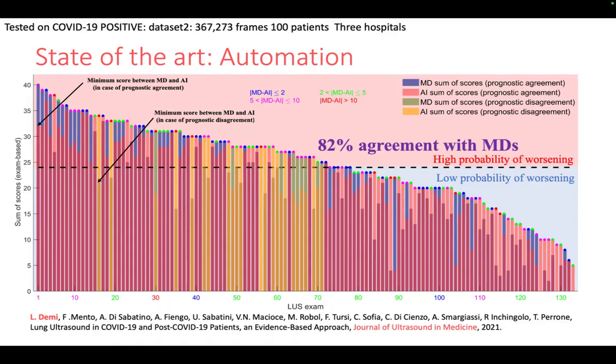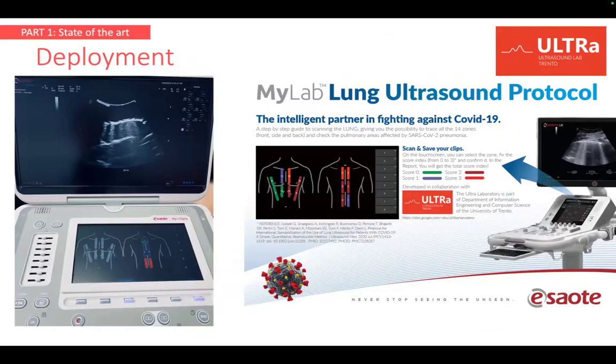And when the clinician realizes the call is wrong, he or she has to overwrite the code. This system was also deployed in a commercial system produced by Esaote in Italy. Okay, so this is the state of the art.